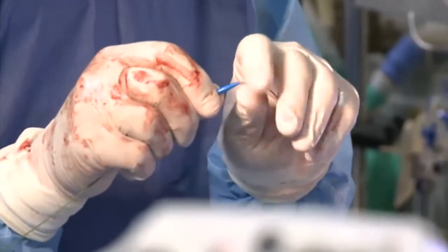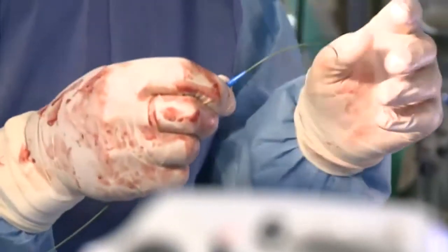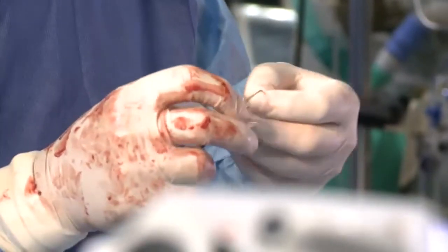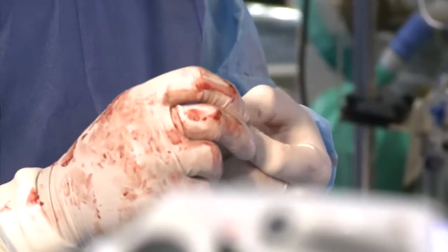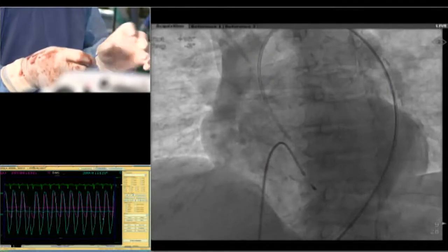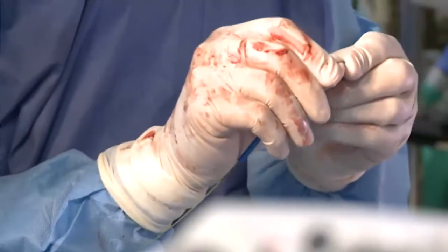So my question is, maybe I would like to have an input from you, Dr. Parikh. What do you think about, should we pre-dilate this balloon valve or not? You look at the gradients, hemodynamic gradients, are they visible to you on the screen? Yeah, we initially saw them, Ravinder, and we were going to ask if somebody can show the gradients. We see them now, yes.